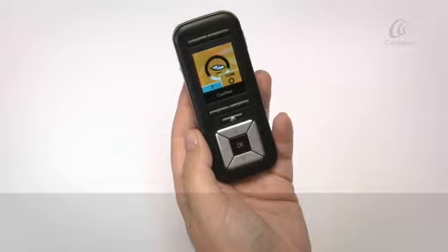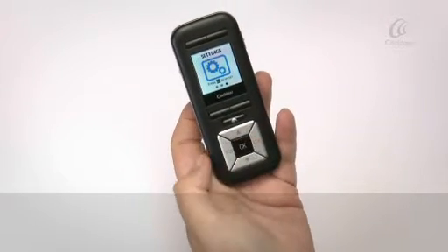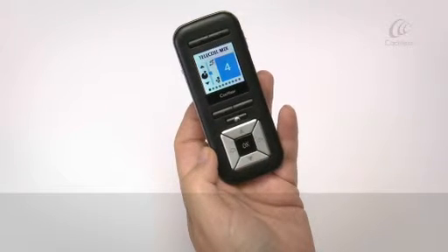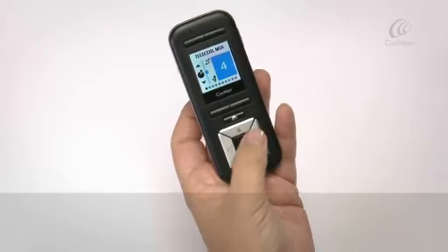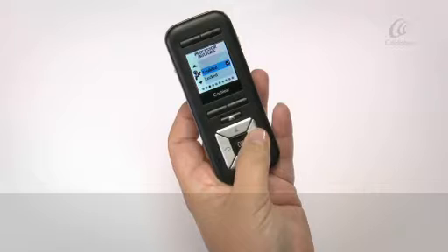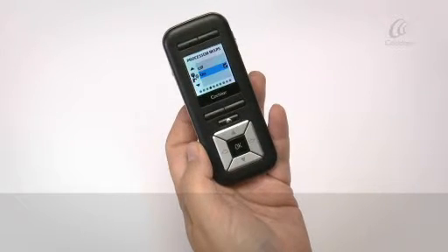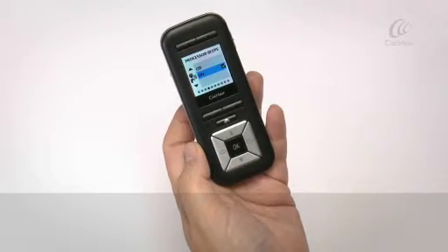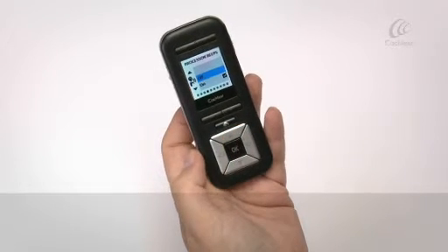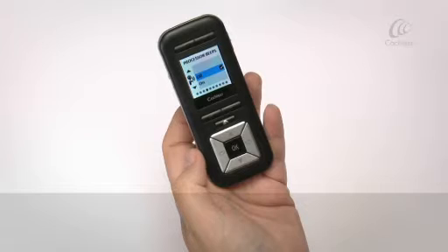Go to the settings screen and press the OK button. Press the right arrow button to navigate to the processor beeps screen. Press the up or down arrow button to highlight off or on, then press the OK button to select.